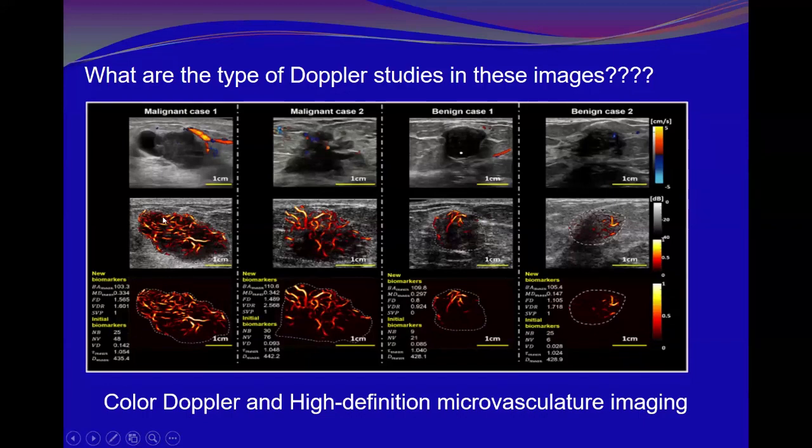This is mammary cancer, both invasive ductal and invasive lobular cancer. But here, this is obviously spiculated. Though it is spiculated, with this minimal peripheral vascularity, it can be sclerosing adenosis, complex sclerosing lesions, or it can be malignancy. But it is more suspicious, more highly suspicious than this one.